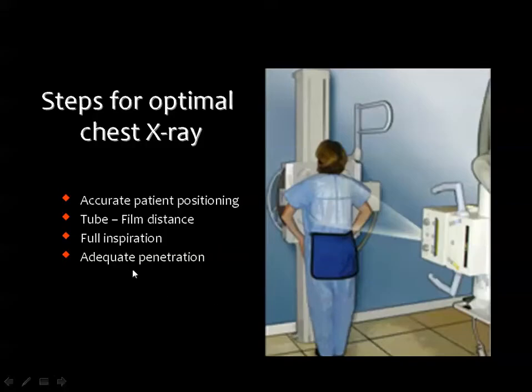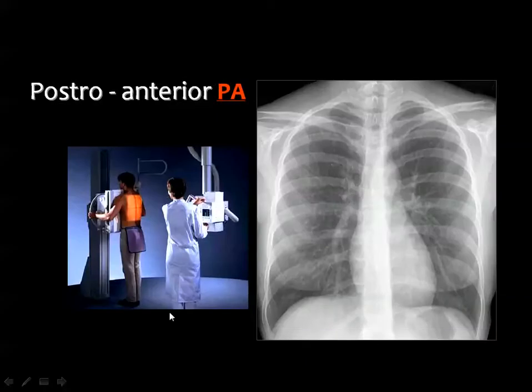And we select the radiographic factors which are suitable to the size of the human body. Then how can you know these parameters in detail while you are not attending the technique of chest radiography? Then we should go first for some radiographic terminologies, and you all know, especially the radiologists, that the most popular chest x-ray at all is known as the PA view.